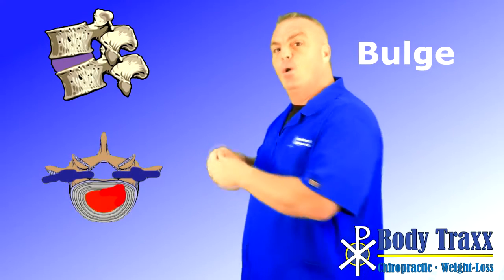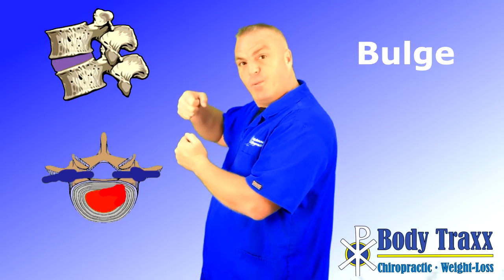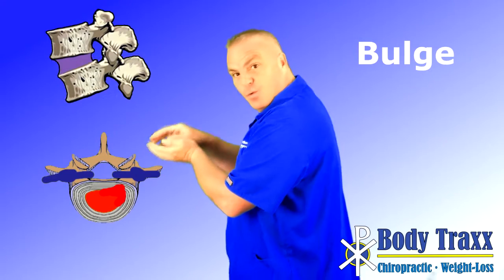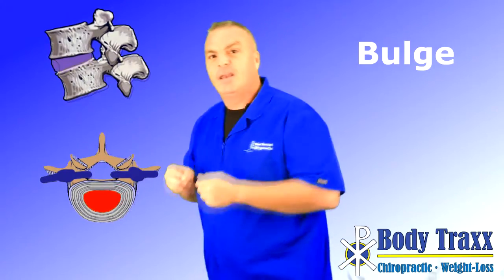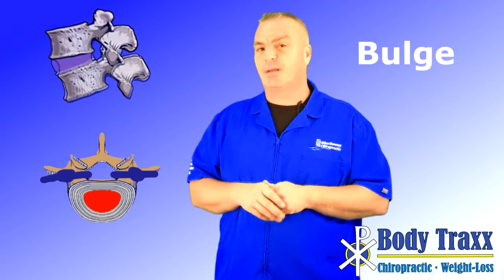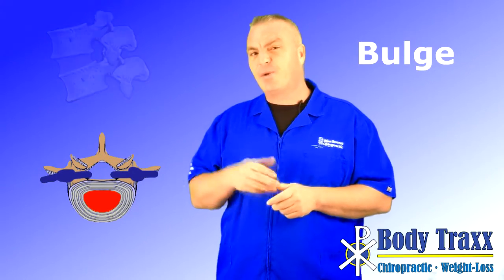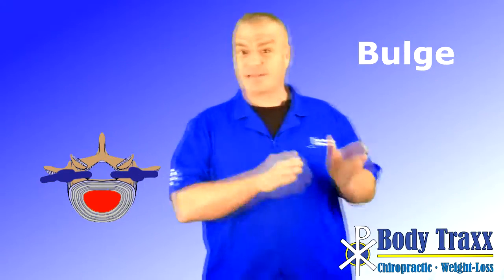All right, so once we can get that imbibition starting to happen where the vertebrae are pulled apart, that red part, that disc, will actually be sucked back in. Now with the disc bulge, I'm not sure exactly how much care you're going to need, but I can make an educated guess. Probably 10 to 16 visits. All right, so let's go to the next level.